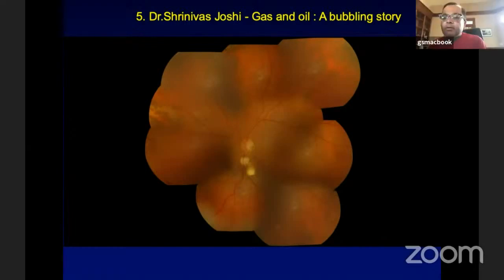I think you've had a great outcome from a case with a lot of issues, but I would like to ask Pramod, just let's go back in time. The whole issue of fish eggs. Pramod, how do you prevent that from occurring in pneumatic retinopexy? What is your bubble injection technique?